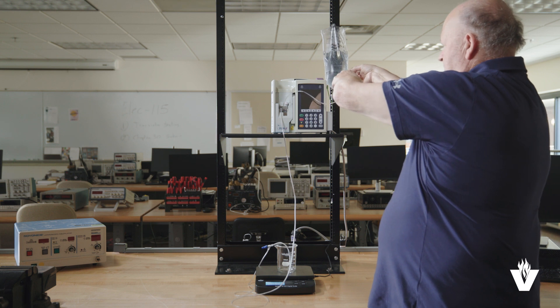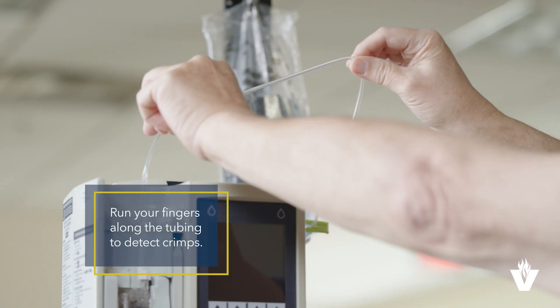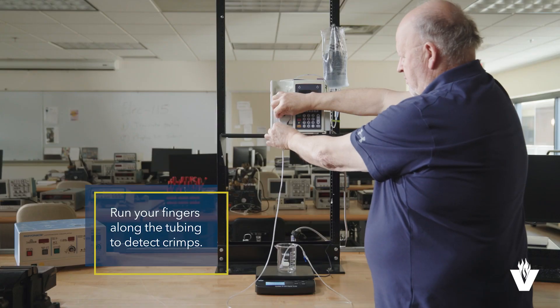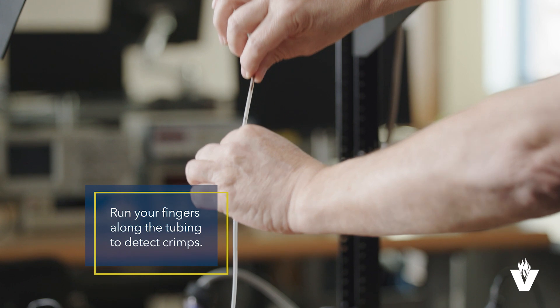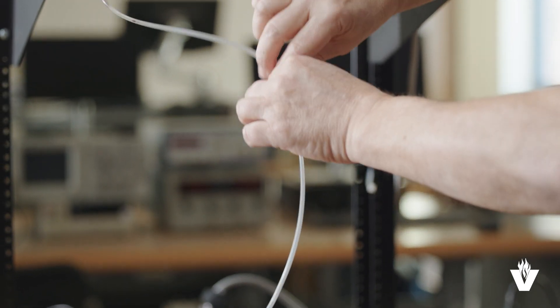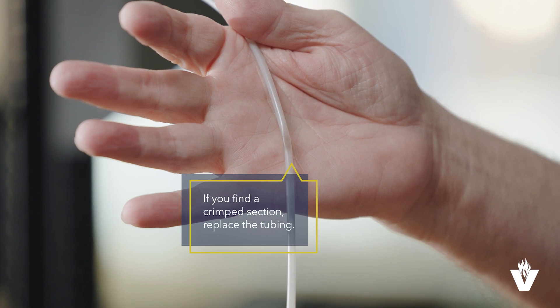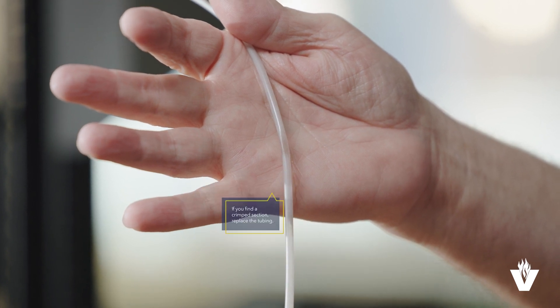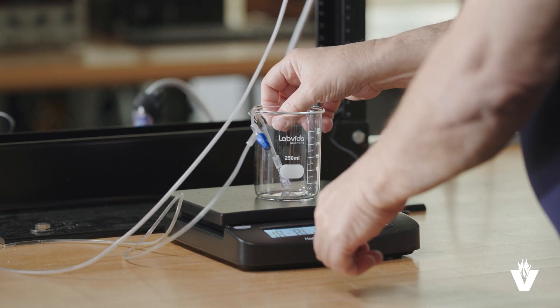Next, feed the IV tubing to and through the IV pump, paying attention to not crimp the tubing on either side of the pump being tested. On the output side of the pump, feed tubing into the beaker that is placed on a scale.